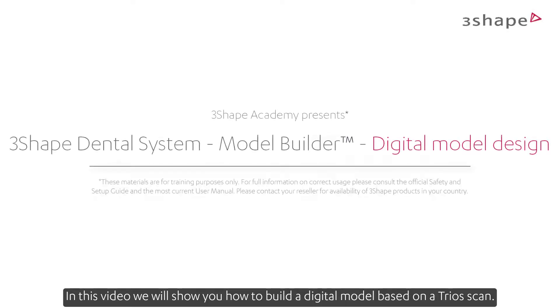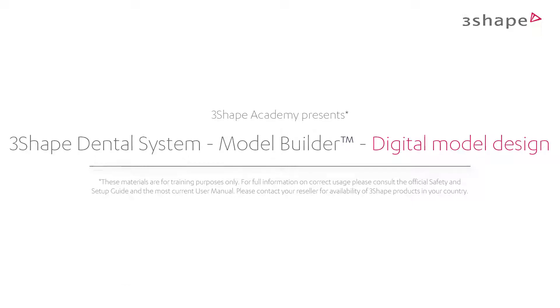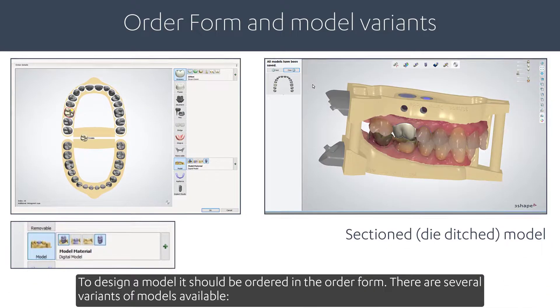In this video, we will show you how to build a digital model based on a TRIOS scan. To design a model, it should be ordered in the order form. There are several variants of models available.